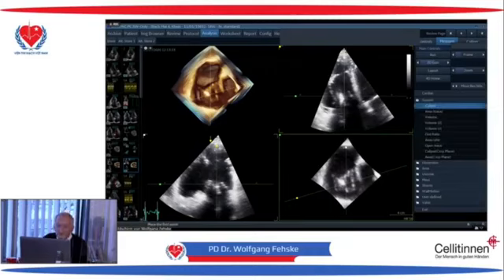This is a gap between the leaflets which correspond to that gap and to that gap. This is 1.6 to 2.4 centimeters, and this is for no intervention possible to get this managed. So this is absolutely, if at all, a surgical problem. The question now is, okay, yeah. Translate.